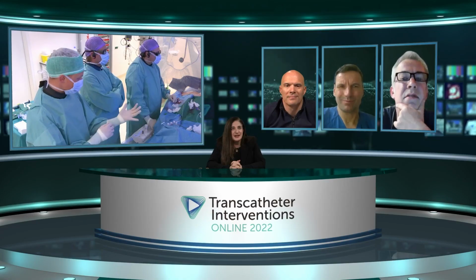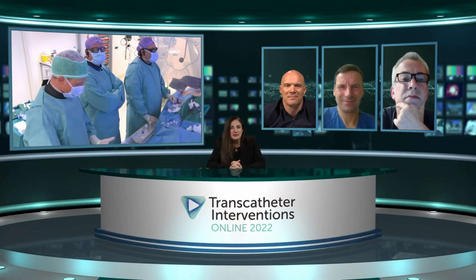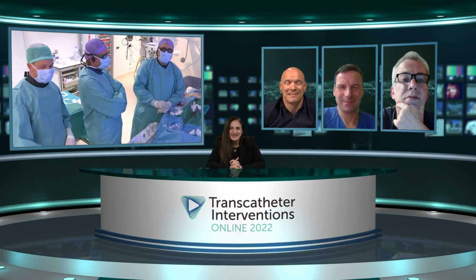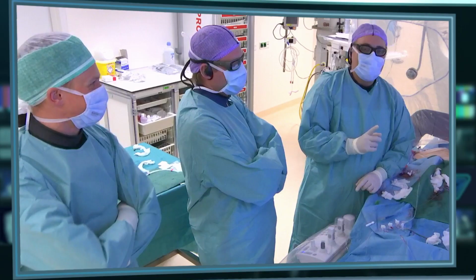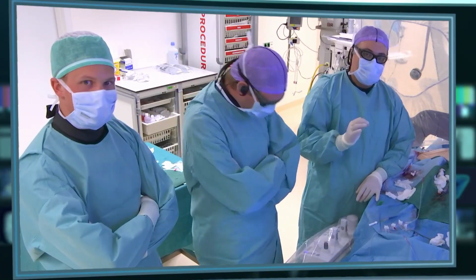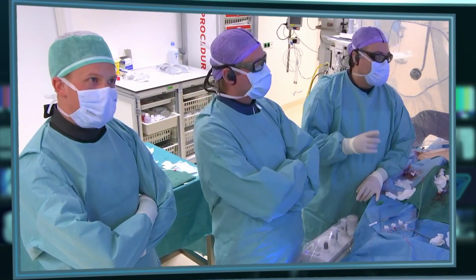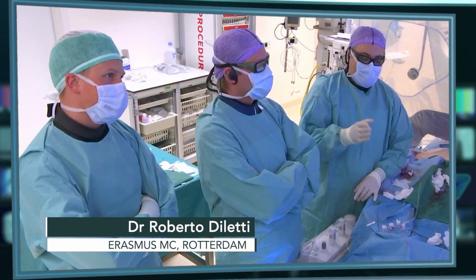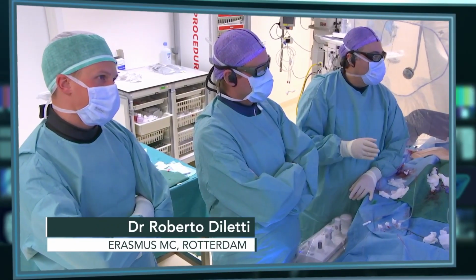Hello there. Tell us what you've been doing. Yes, a lot of nice things. Good. Maybe we can show one thing. So basically, we advanced the microcatheter. We redirected the knuckle because it was going into a diagonal. We saw it, so we redirected.